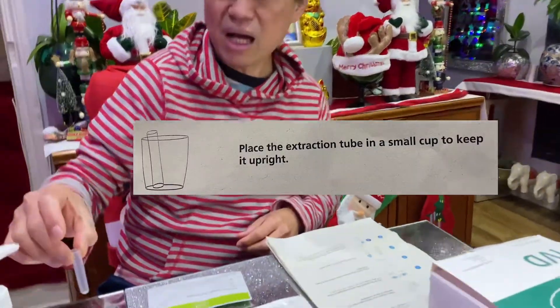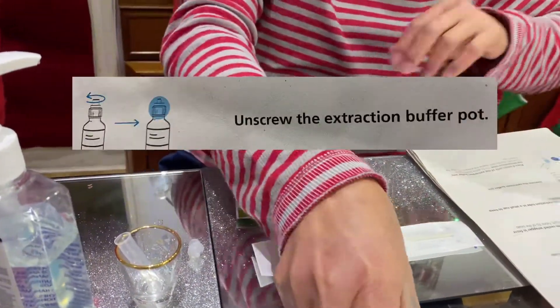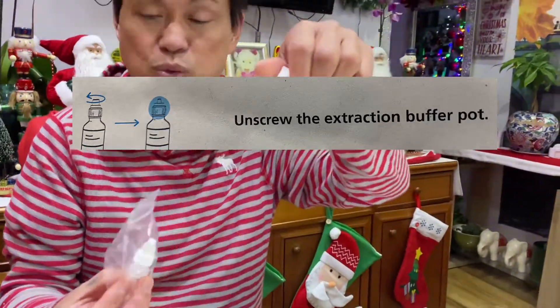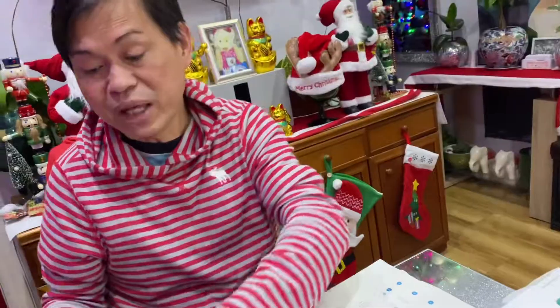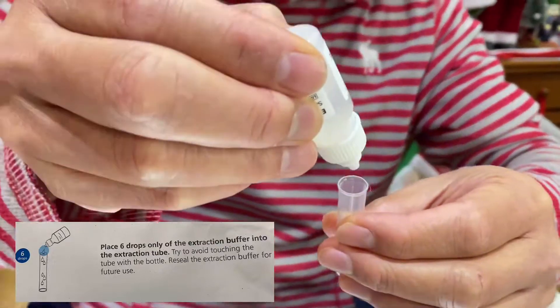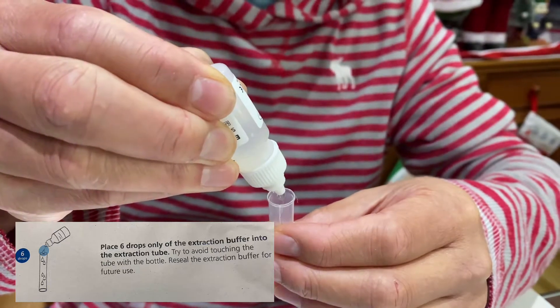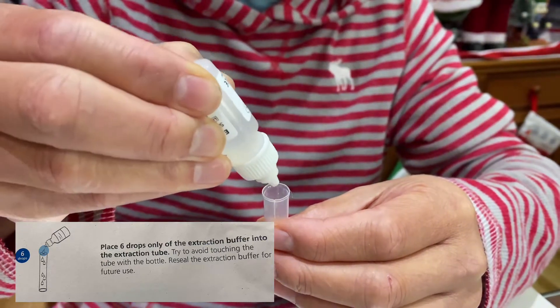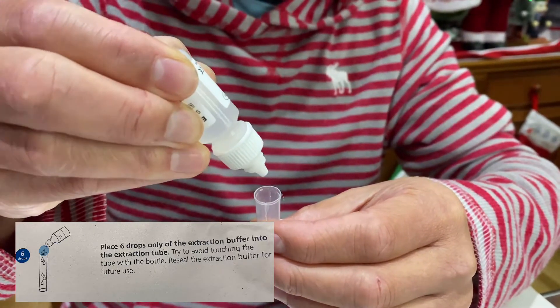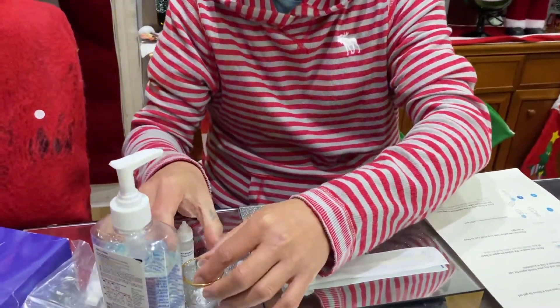Place the extraction tube in a small cup to keep it upright. Then unscrew the extraction buffer bottle — we only use one — and place six drops into the tube: one, two, three, four, five, six. Then leave it there.